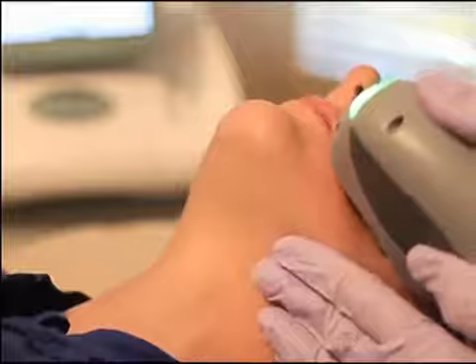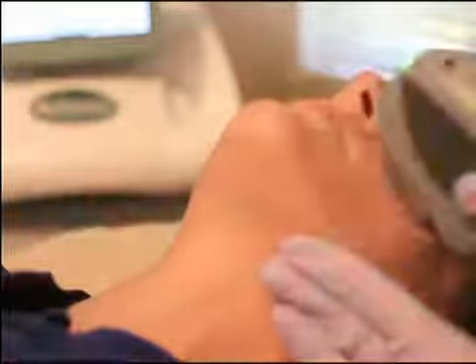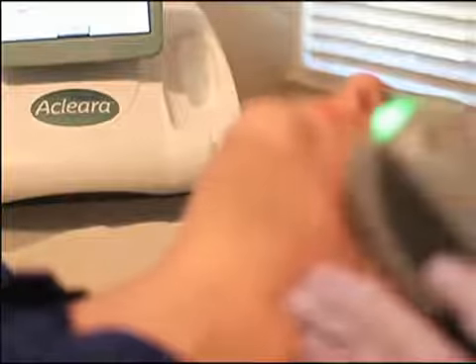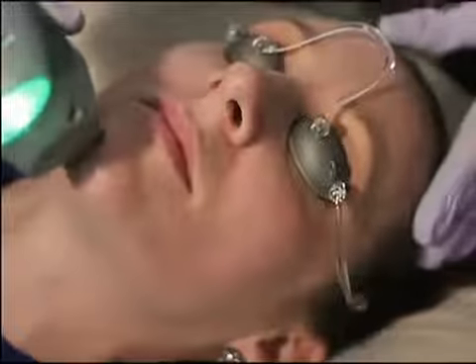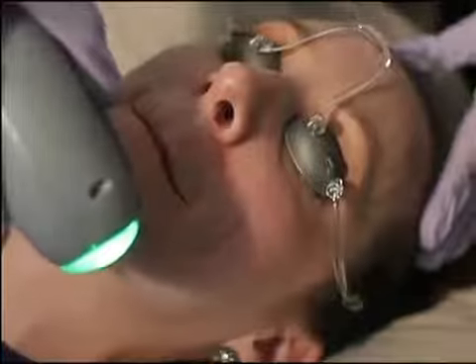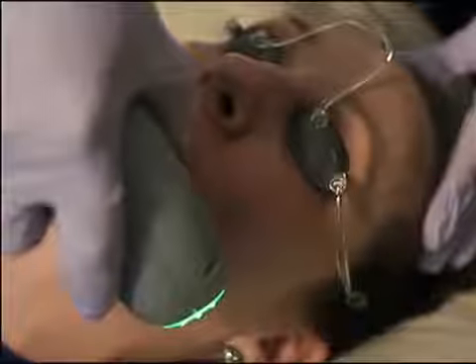And we're looking at it right now, Dr. Germain. So, what's happening there? Yeah, so that handpiece is applied to the skin, and then gentle suction is put onto the skin, and all that little wormy kind of cheesy material from your pores all comes out. And then after the pores are cleared out, the laser lases the skin gently and just stops the oil production, decreases the pore size. The laser also decreases inflammation and redness in the skin.